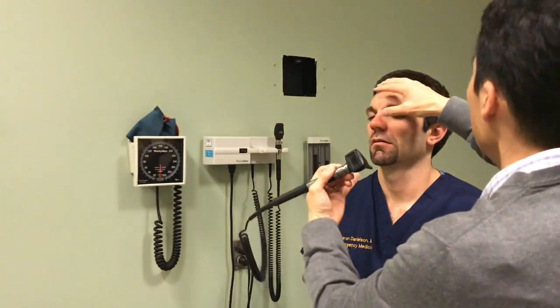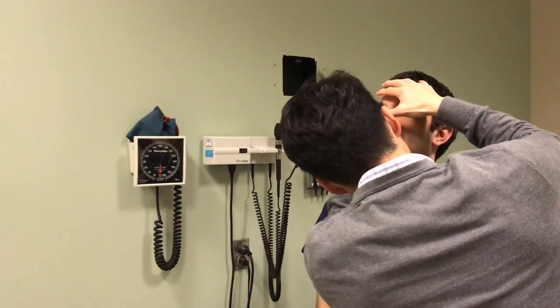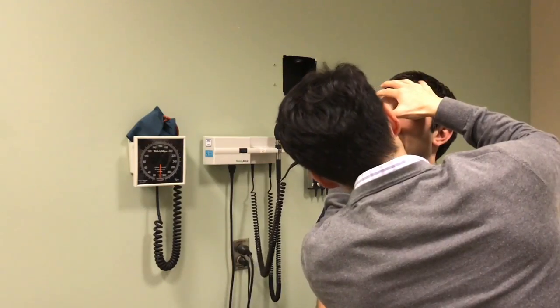Of note, asking the patient to breathe out of his mouth instead of his nose during this exam can help avoid fogging up the otoscope.